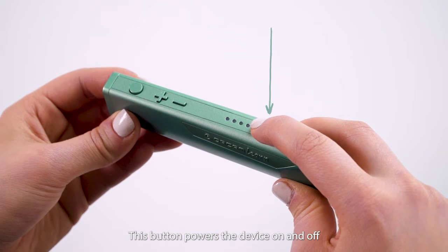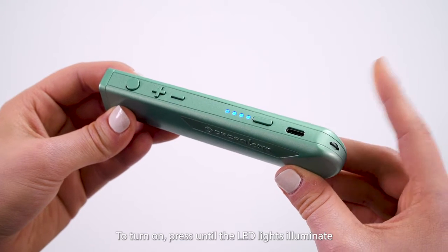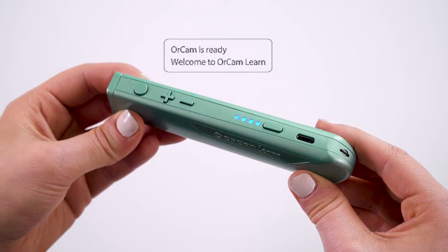This button powers the device on and off. To turn on, press until the LED lights illuminate and then wait to hear the device's announcements: OrCam is ready. Welcome to OrCam Learn.